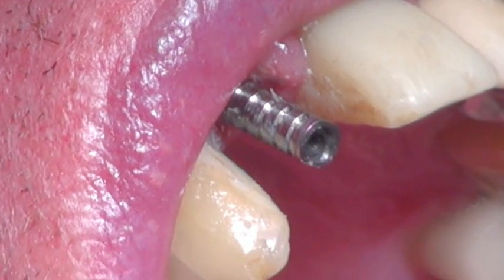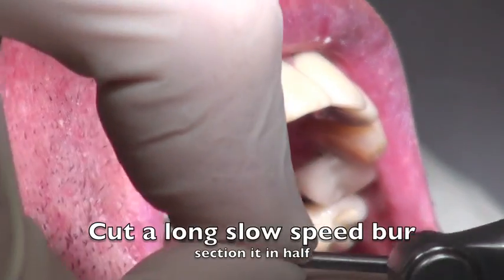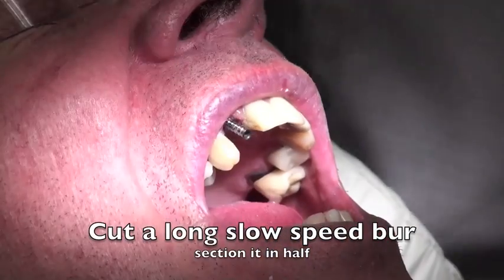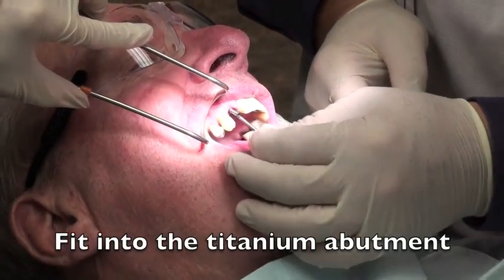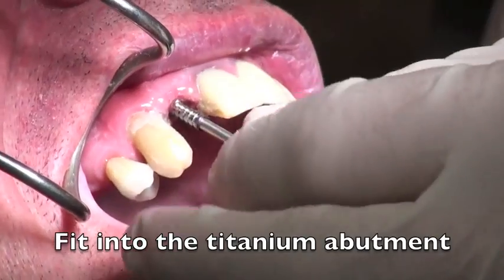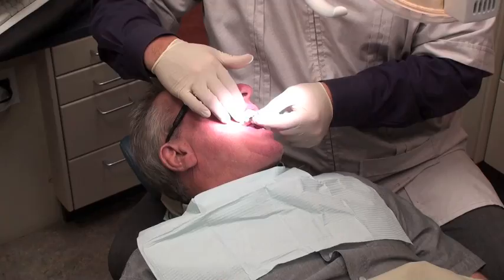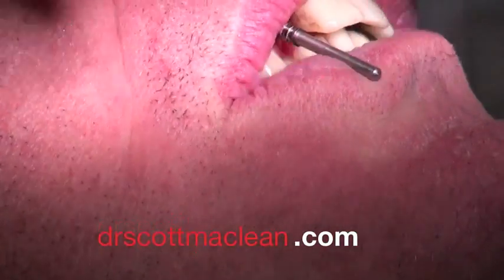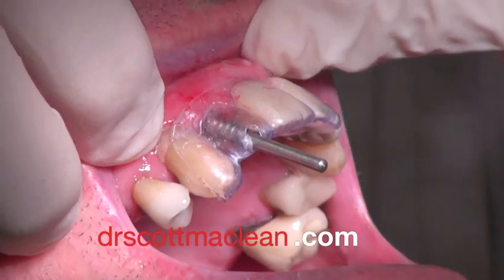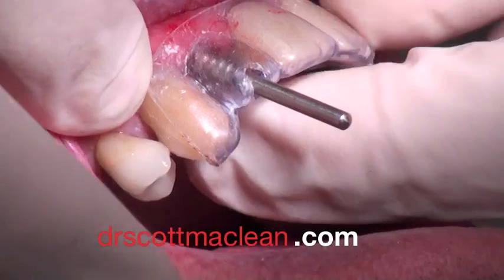The next step involves getting something to fill that hole prior to having the temporary abutment shaped and modified. What I use in this case is a long slow-speed burr, cut in half. It fits quite nicely into the titanium abutment. This little plug acts to stop the resin from going up into the screw area so we can take this on and off. We place this little pin — the burr handle — in, and then place the stent over top of it, so we're able to modify this by adding resin in the area and do our pick-up.